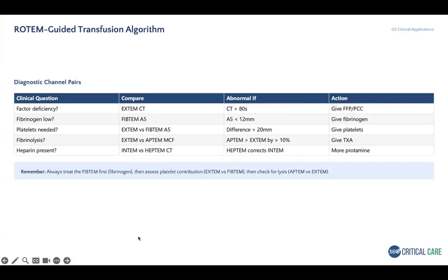So this is the basics of ROTEM. You need to understand this. I think if you memorize this table and try to interpret the picture depending on this table, it will be easier for you. But again, we will be touching on this repeatedly in our course and in the CBS and CCS multiple times, so that at least you get prepared for the exam to answer the questions.